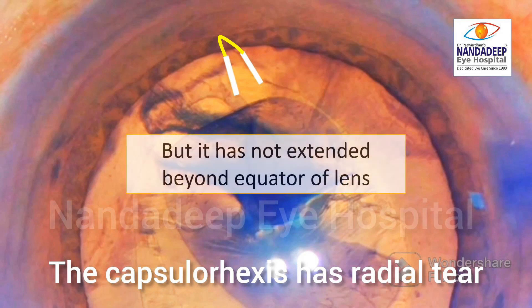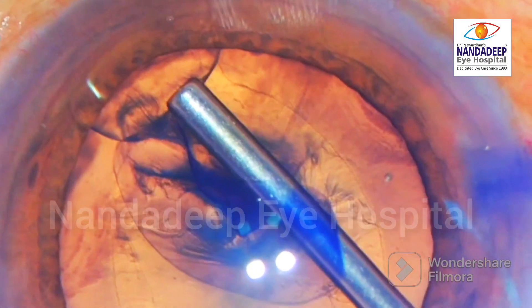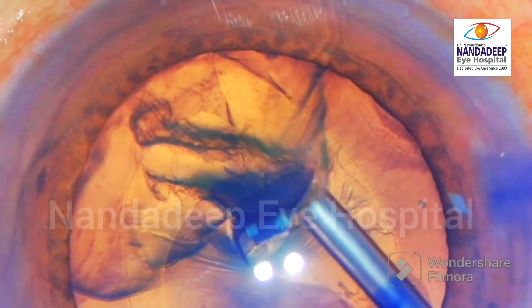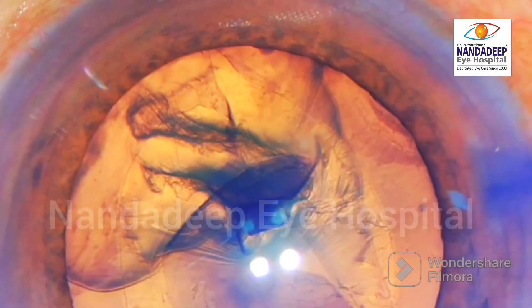So in this situation, we can still retrieve the capsulorhexis and what we are going to do is put some heavy dispersive OVD over that area. Now you can see that radial tear which is there but has not extended beyond the equator of the lens.